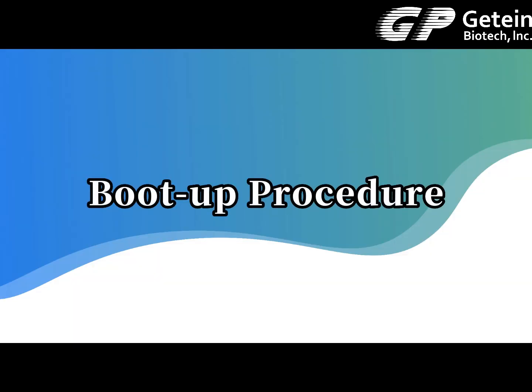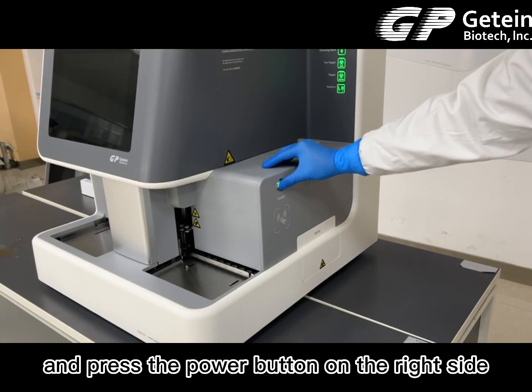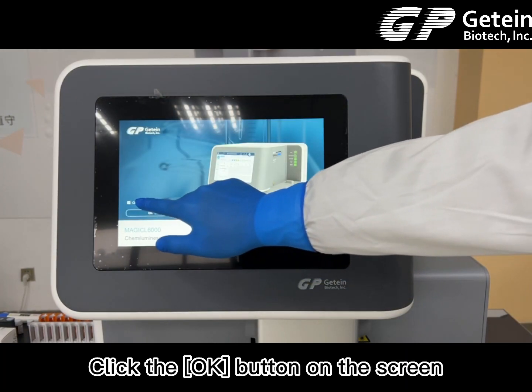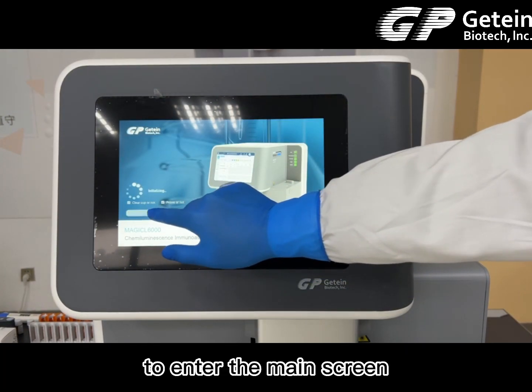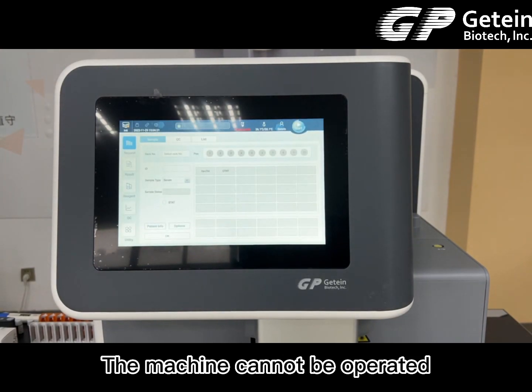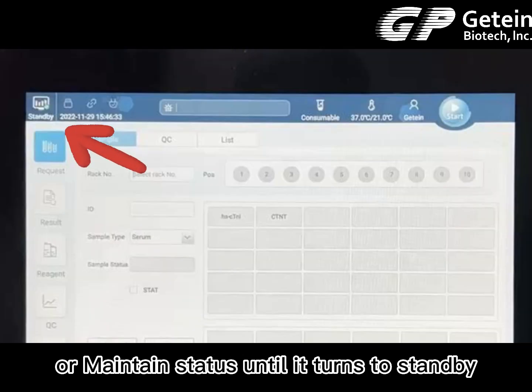Boot-up procedure: turn on the main switch behind the machine and press the power button on the right side. Click the OK button on the screen to enter the main screen and wait for the machine to warm up. The machine cannot be operated when the icon in the top left corner shows init or maintain status — wait until it turns to standby.